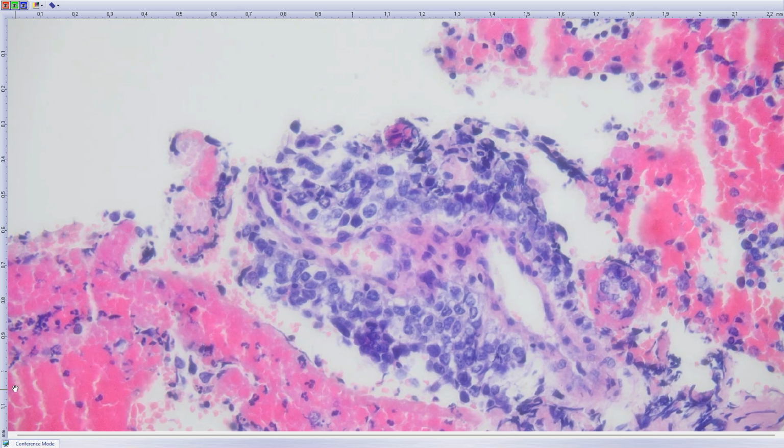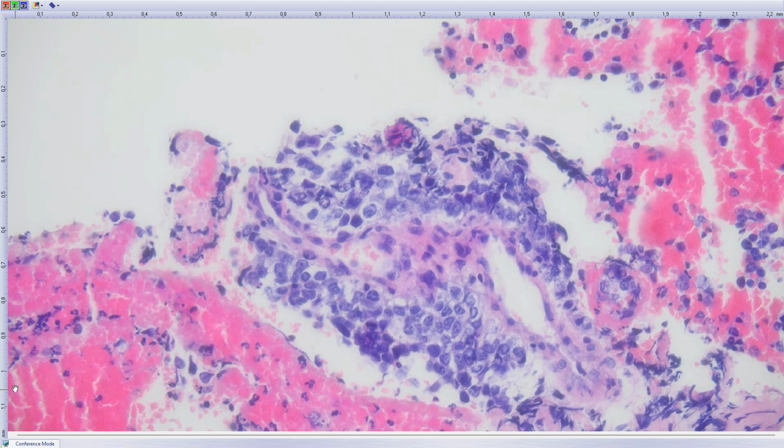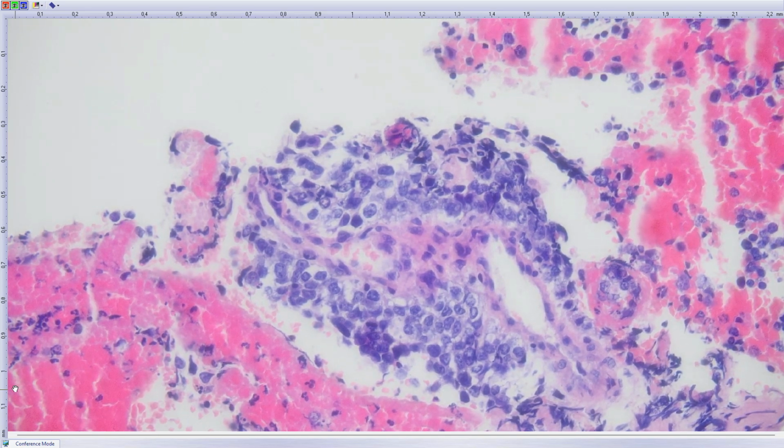Regarding the PRAME antibody, it shouldn't be used as a melanoma marker. You can use it only in your differential diagnosis between benign and malignant melanocytic lesions. Otherwise, you are in trouble. PRAME will be positive in many malignancies all over the body, so it's not a melanoma marker.